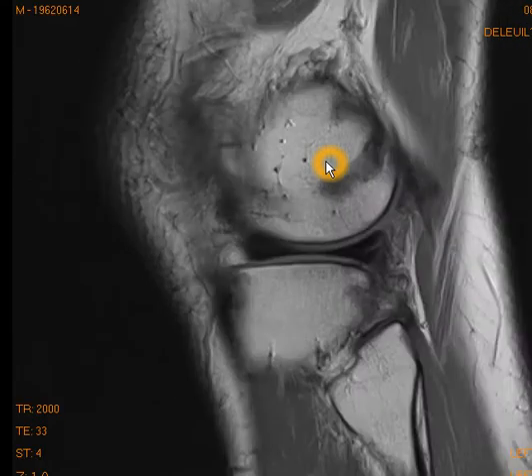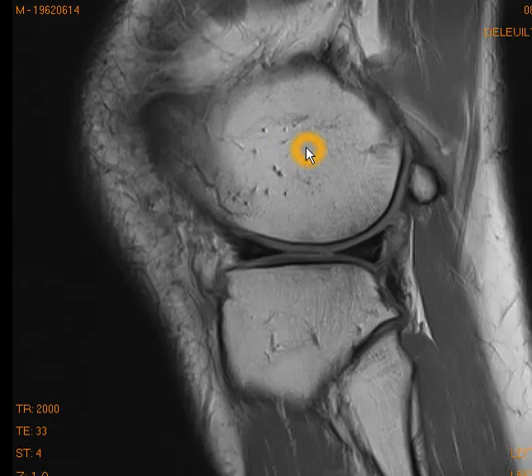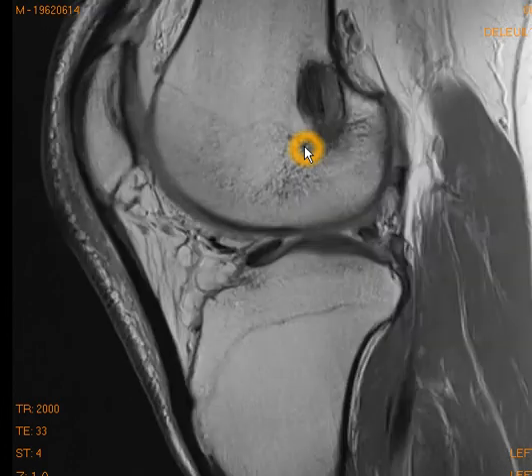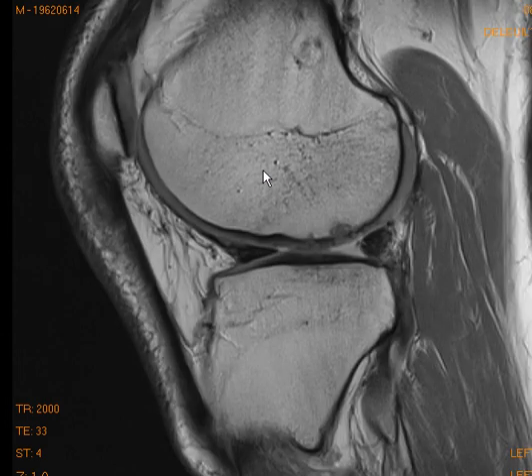That's a quick summary and review of your right and left MRI of the knee. Hopefully you can overcome these problems and get back to cycling in some form, but hopefully going over these will help you better understand what's going on.